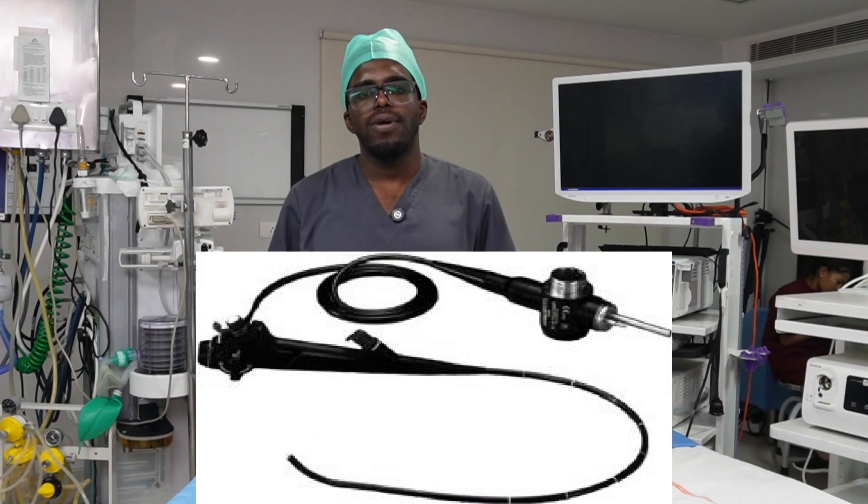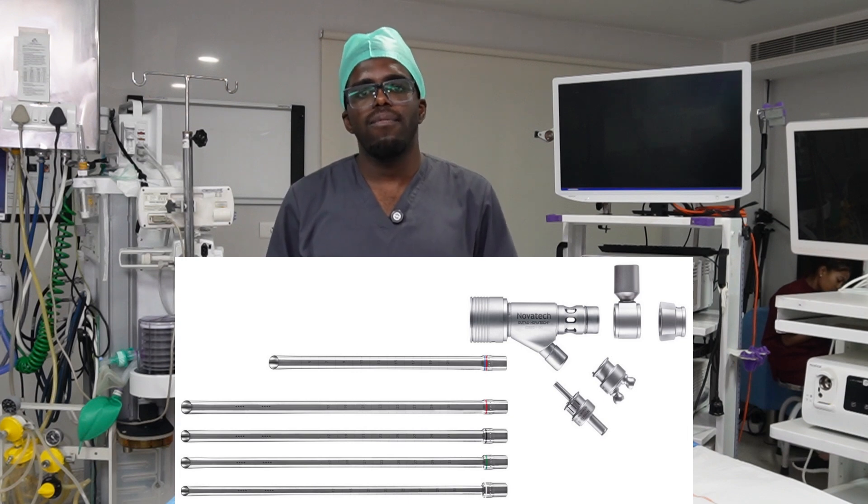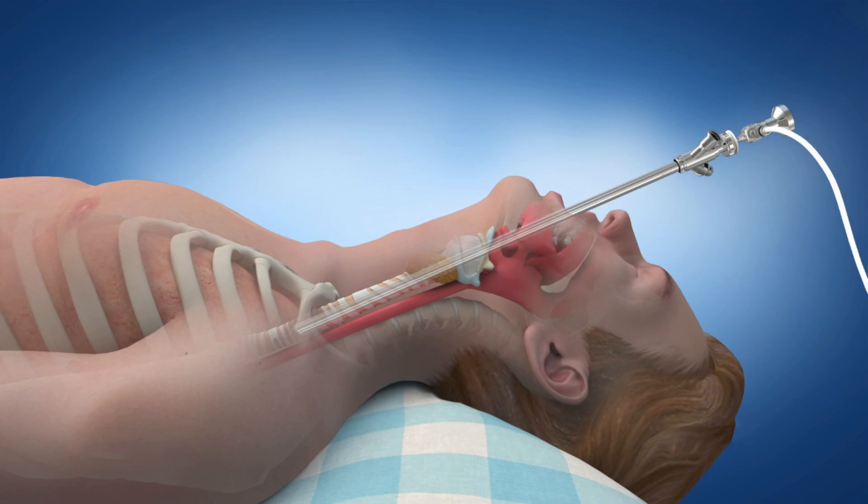The first is flexible bronchoscopy, which is the most commonly performed for diagnostic purposes and minor interventions. The second type is rigid bronchoscopy, which is mainly reserved for complex procedures like removal of large foreign bodies or controlling large airway bleeds.